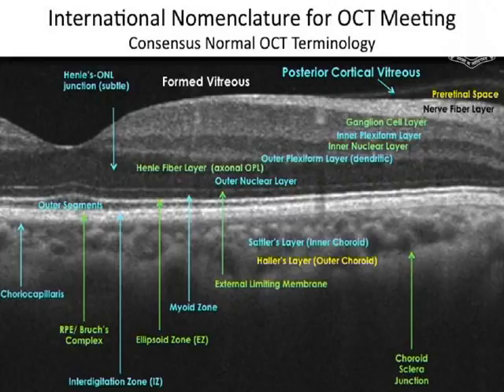And this is generally elevated here because if we look at the anatomy, the cones are elongated in the fovea. So this always seems elevated. This is not a fluid and should not be mistaken for fluid. And this is what is the outer segment. Then we come to this hyperreflective layer here, which is the interdigitation zone, followed by the RPE Bruch's membrane.